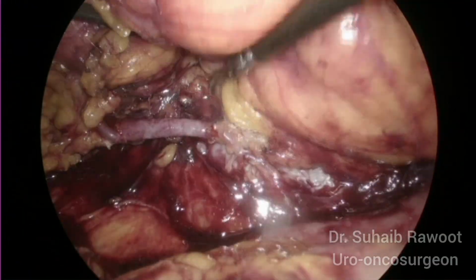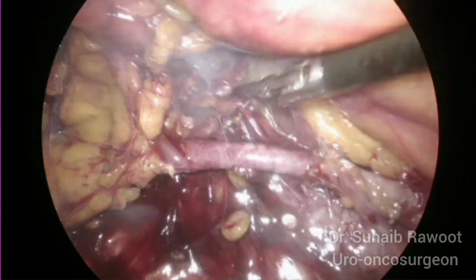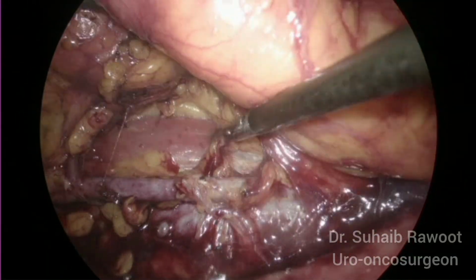So that is how I'm doing it. I'm lifting the fascia upwards and the psoas is now visible. See, the psoas is clearly visible now.